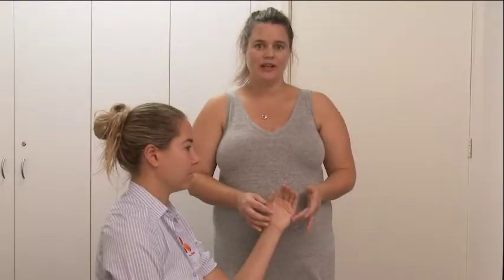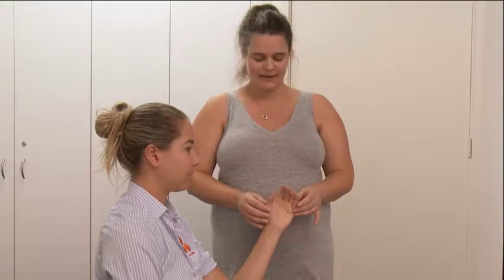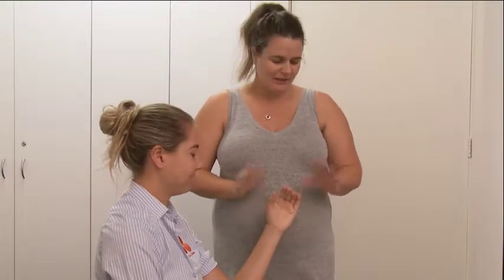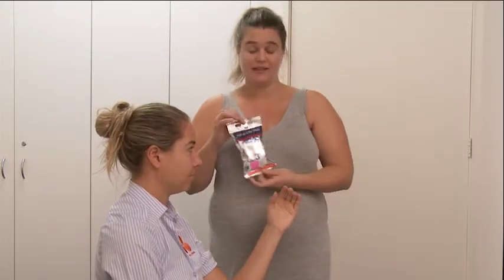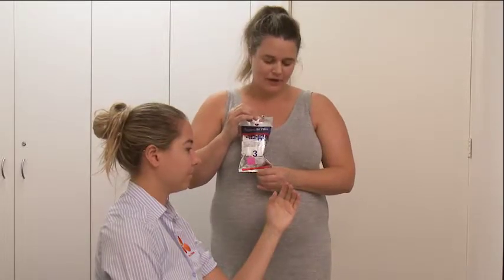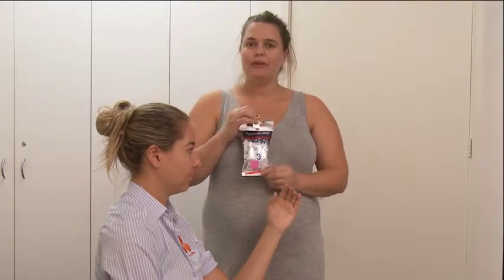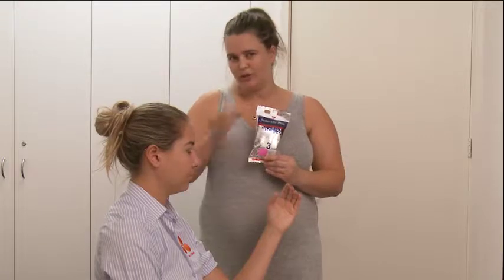What I'm going to demonstrate today is how to apply a fiberglass scaphoid cast. I've got my lovely patient Sheena here today. The material you're going to need is a three inch Delta Light — it's a waterproof cast material. I'm using the three inch on Sheena because she does have quite a long arm. If it was a child or a smaller woman you might get away with a two inch.